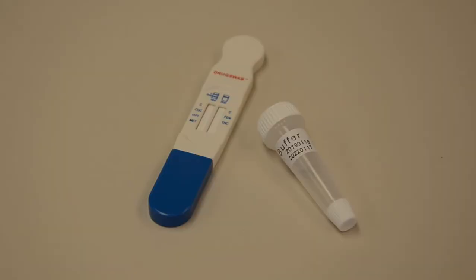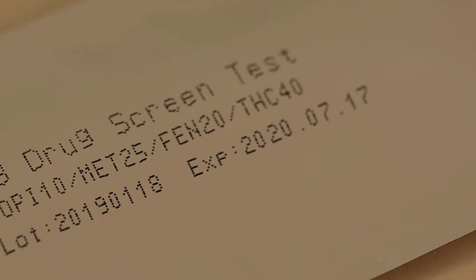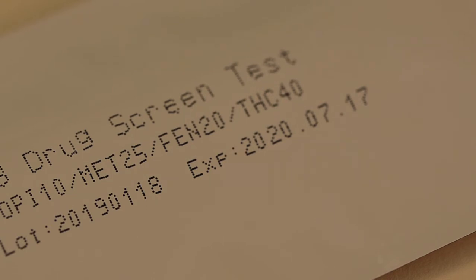Each drug swab test kit includes the test and a vial with buffer solution. Each kit is marked with an expiration date. Use of a kit that is expired may not give accurate results.